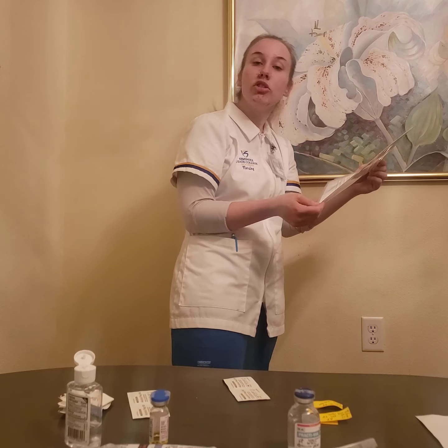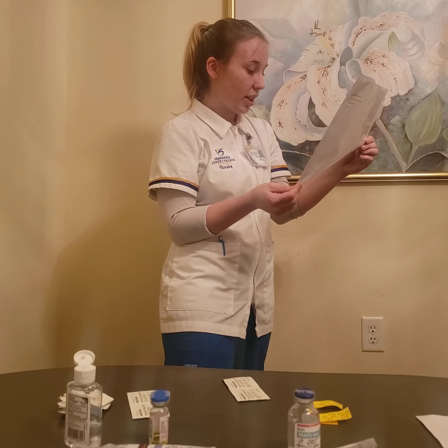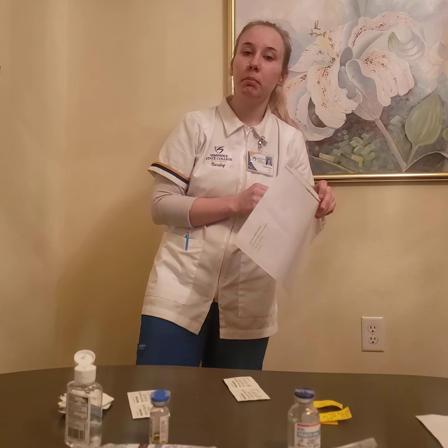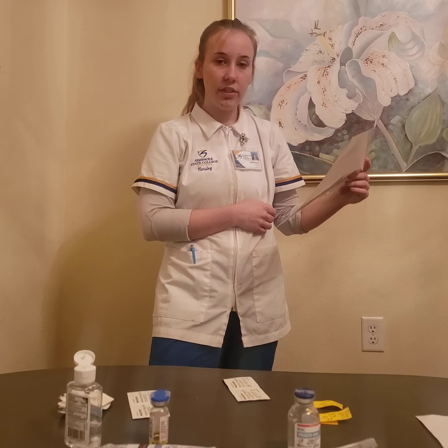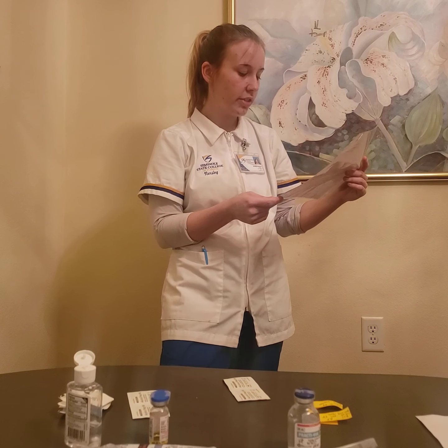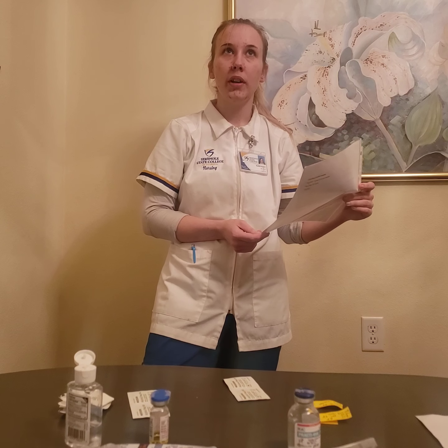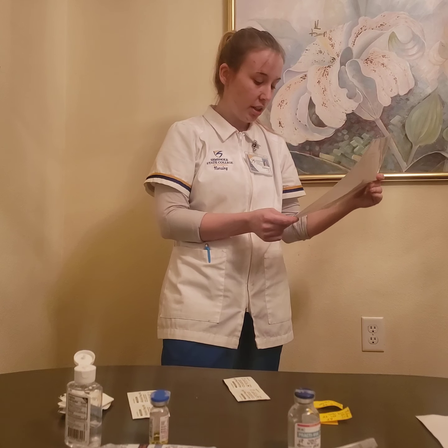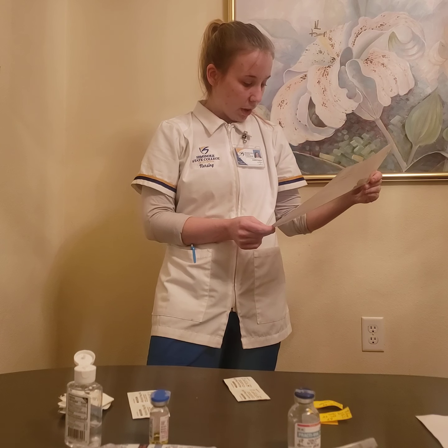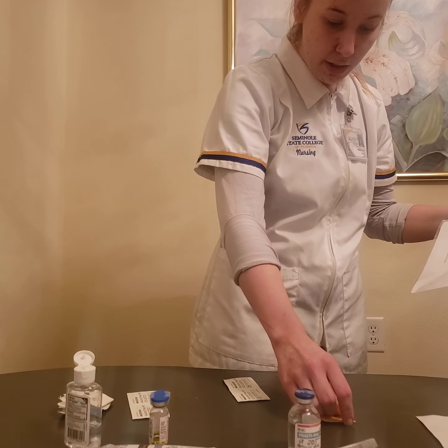It's ordered that I give 500 micrograms today to Ms. Anna Pawlowski at 1300. And it's going to be through the subcutaneous injection route. And that is dispensed as 1 milligram per milliliter. So I do have to do a calculation to get my dosage for that. I can convert 1 milligram to 1,000 micrograms. So I do know that I need to give 0.5 milliliters to get the 500 micrograms of the B12. Okay. So I'm going to go ahead and check that. I'm going to do my first check.